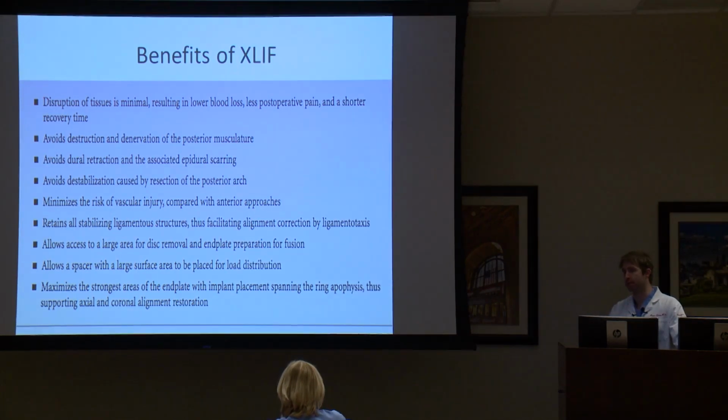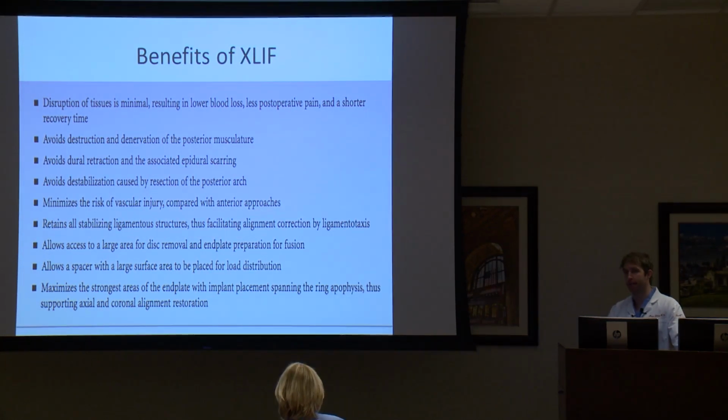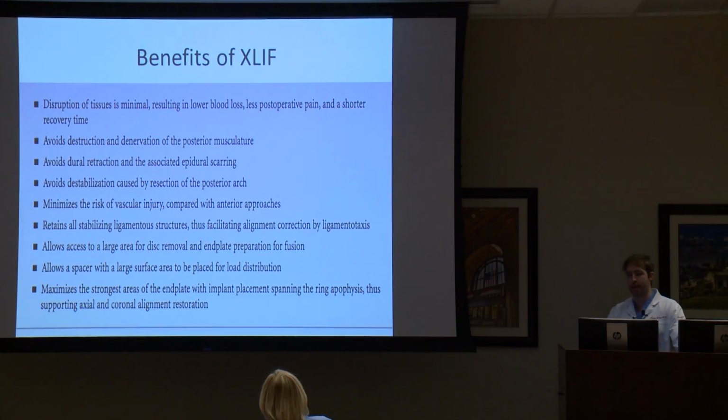Depending on how big your case is, the first 30 minutes to 2 hours is literally just dissection if you're going from the back. And so you don't have that. There's a lot less post-operative pain because we can make an incision about the size of half of my pinky in length. And then less blood loss, less damage to tissues, less post-operative pain equals a shorter recovery time.